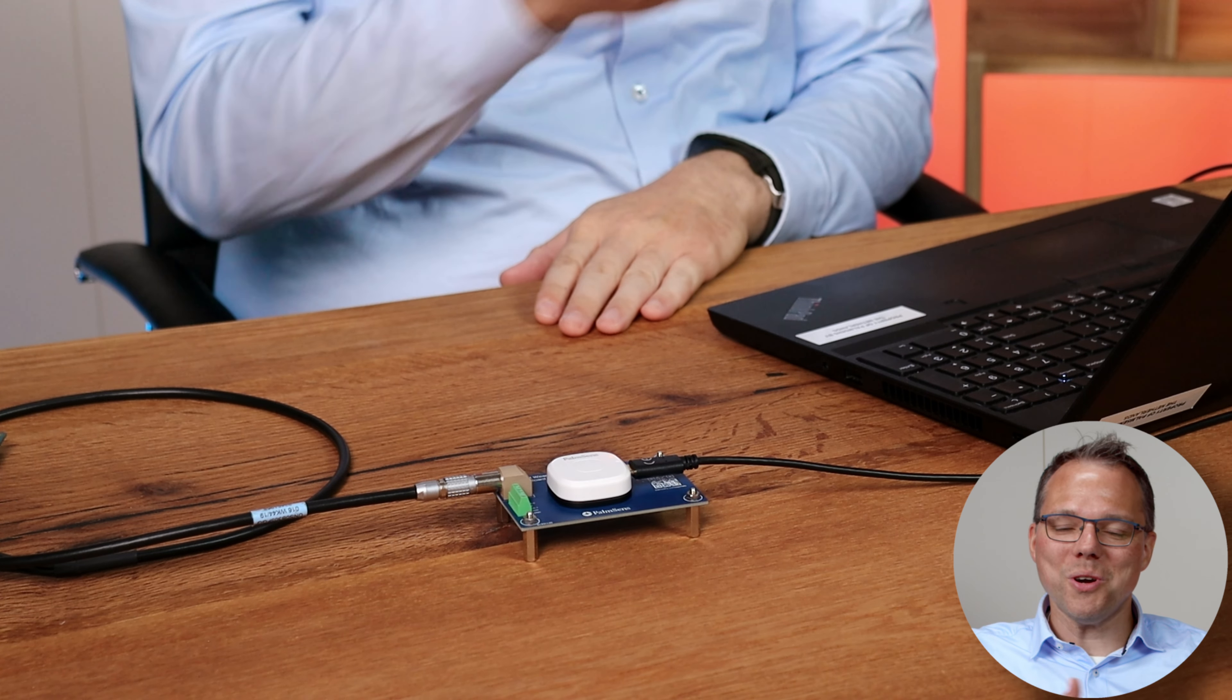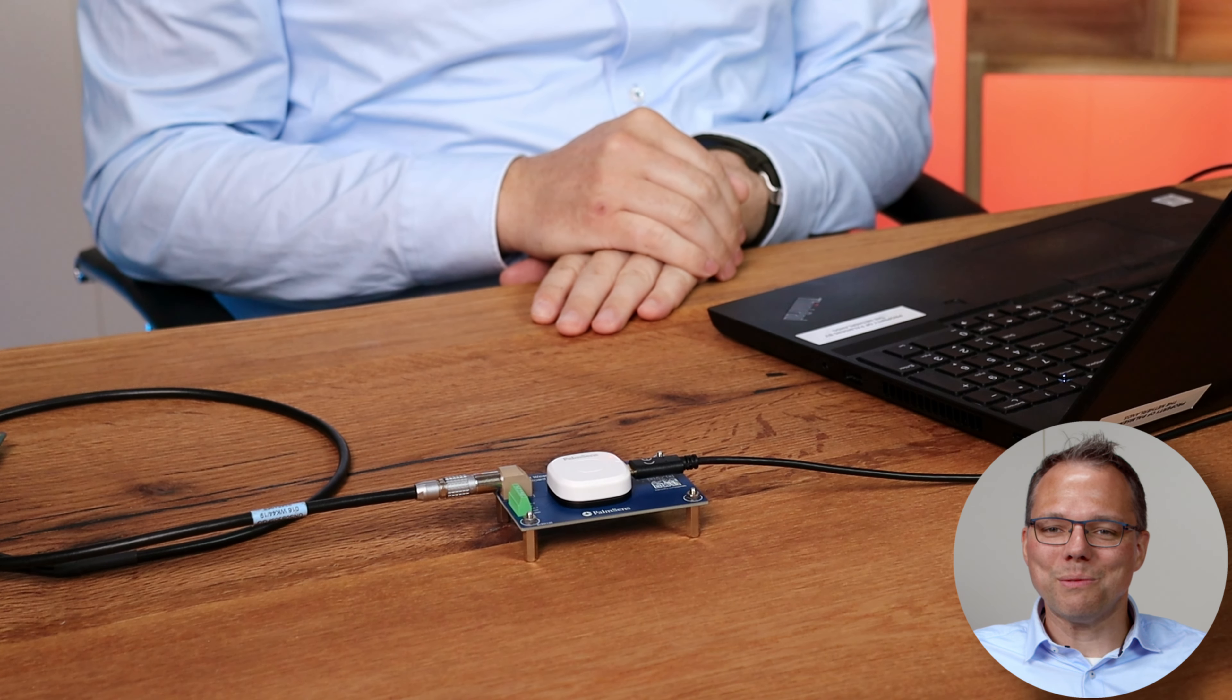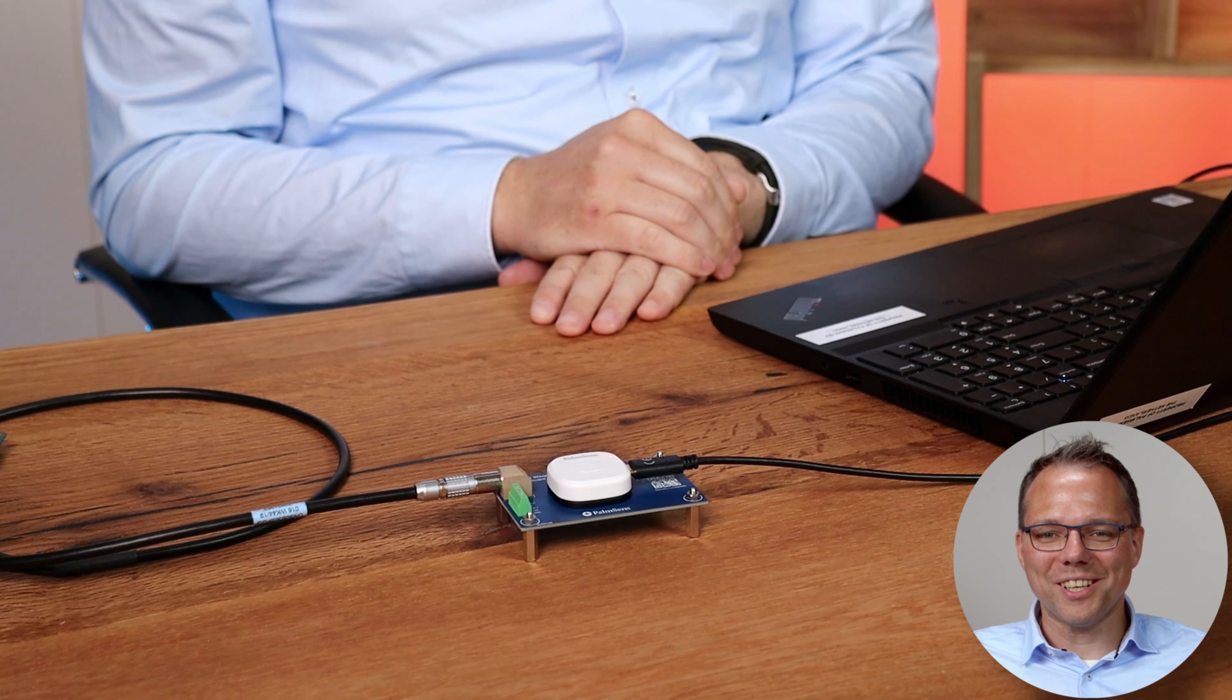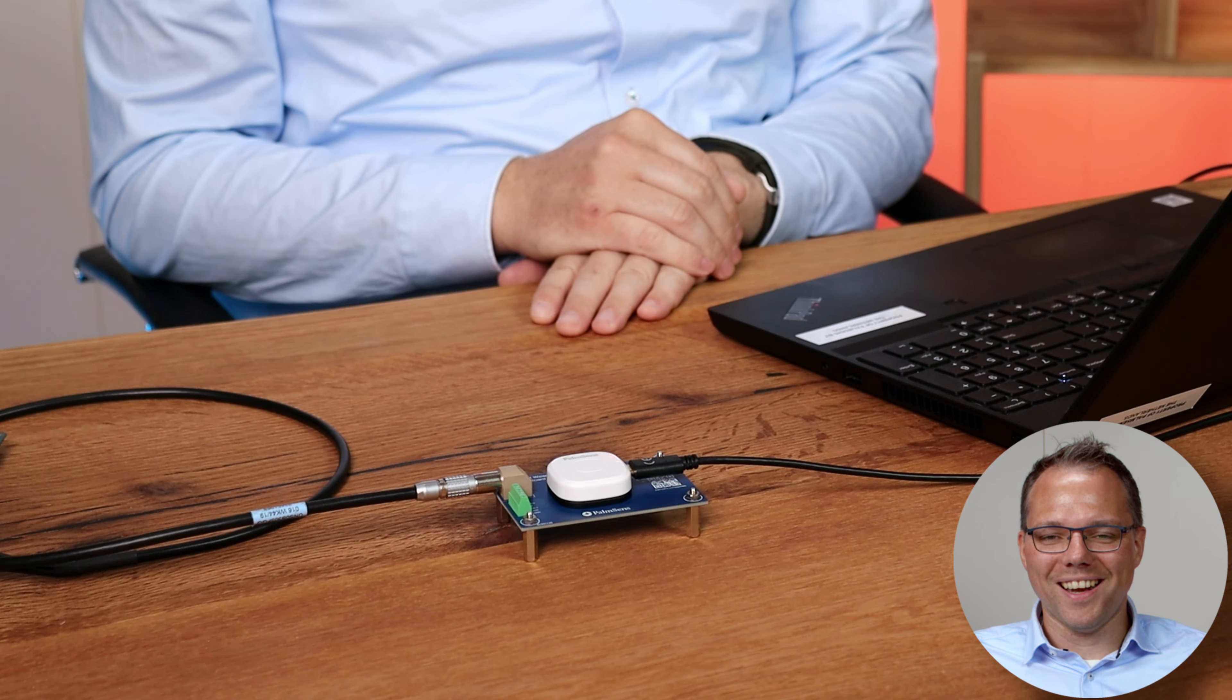So I could also have disconnected it. But for monitoring the repeated measurements, this was the quickest option.